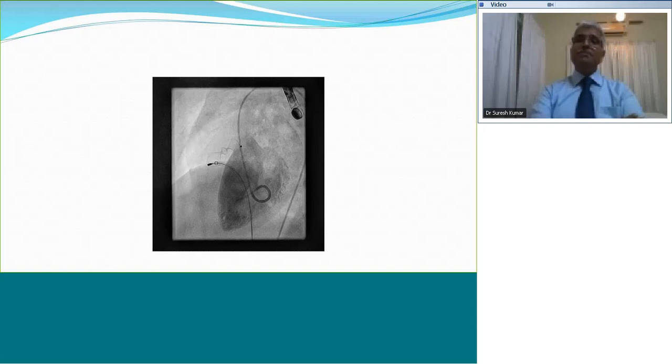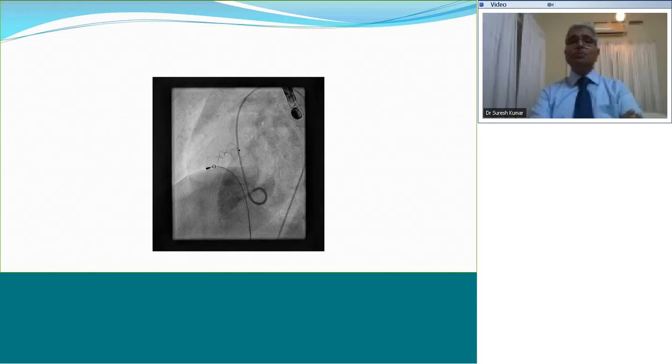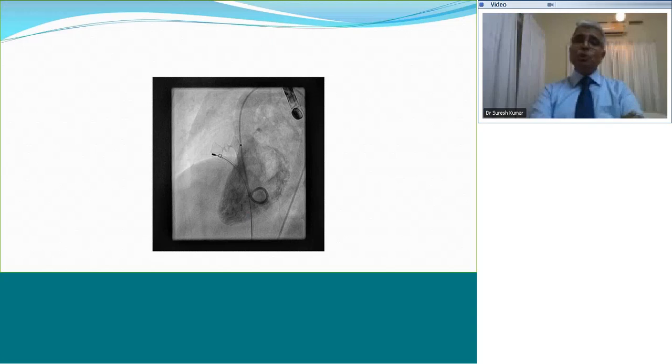I hope you are seeing this. We are back to pretty routine stuff. I would expect this answer very promptly. Yes, but okay, you should say perimembranous VSD closure with an ADO2 device, and it is from the venous side. It's not a retrograde thing. So here an AV loop has been created and the ADO2 device has been deployed from the venous side. So it is an ADO2 device closing a perimembranous VSD.